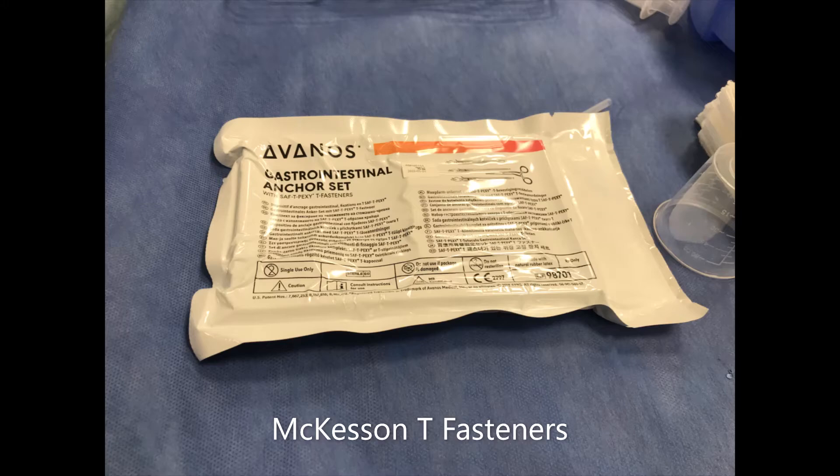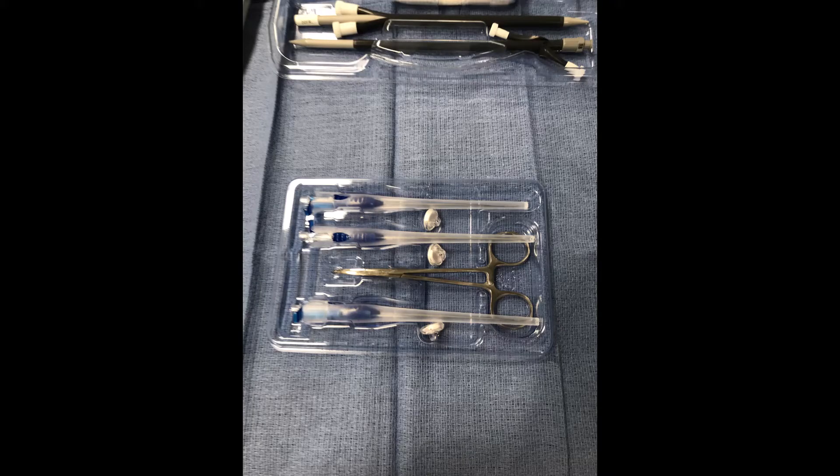Here's a shot of the outside packaging of the T-fasteners that I use. Here we have the actual T-fasteners out of the packaging and on the back table. Three come in a set. I typically only use two T-tacks for G-tube placement, but it's helpful to have an extra, as things happen like misdeployment or dropping one on the floor.